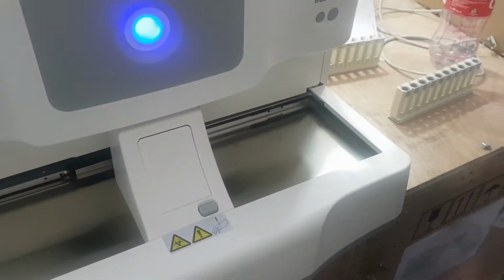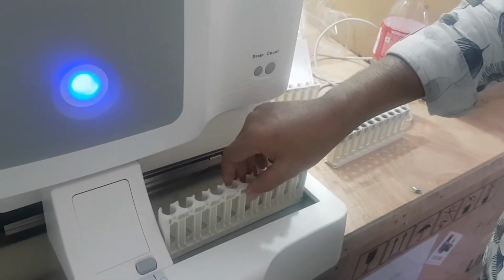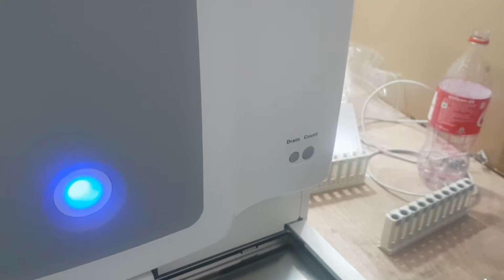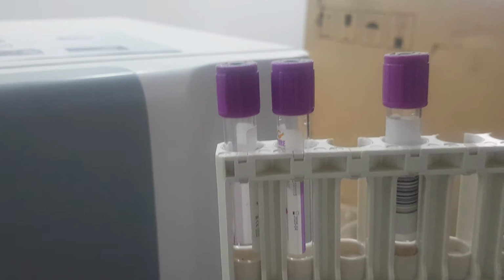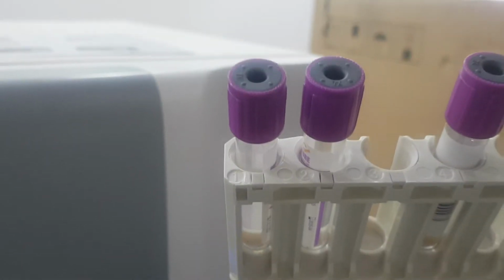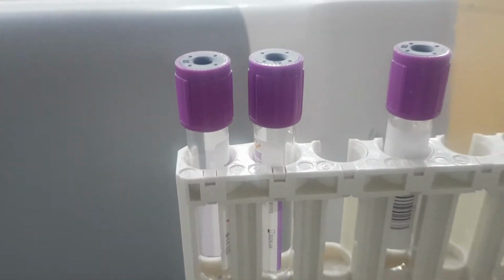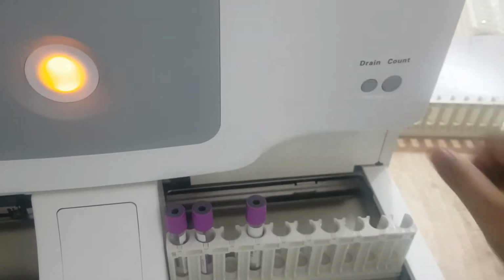Now we are preparing some sample in the rack. Okay, so here what we did, we did not put one tube in a position, so we empty one position. Okay, so there is 3 tube, so we put it in the rack mode, and we start count.